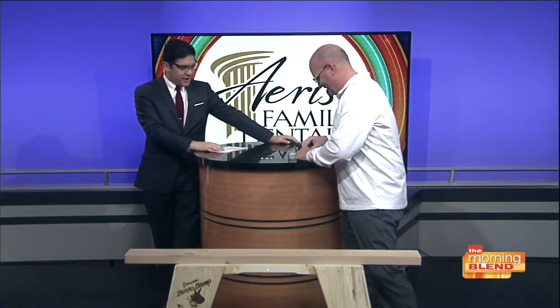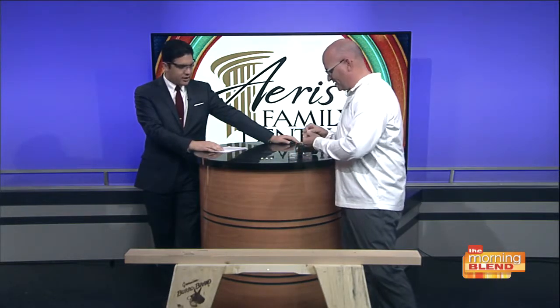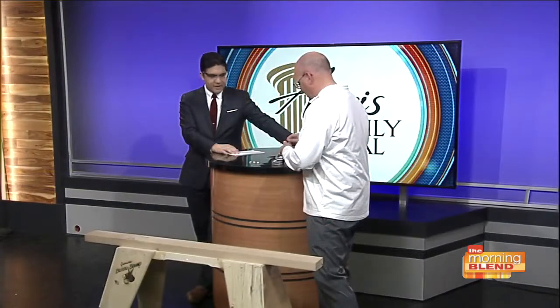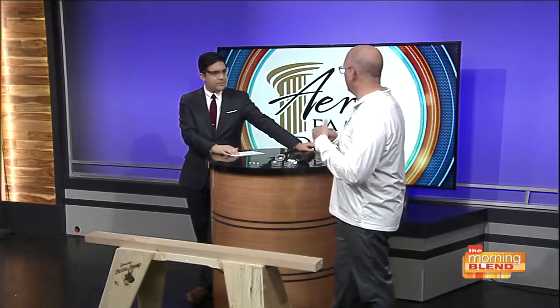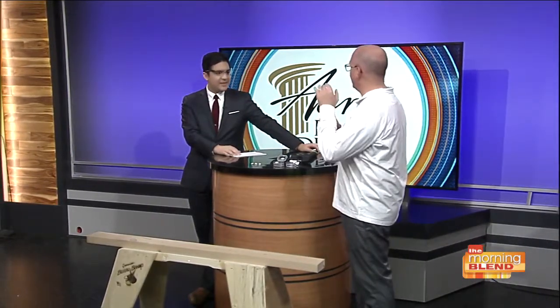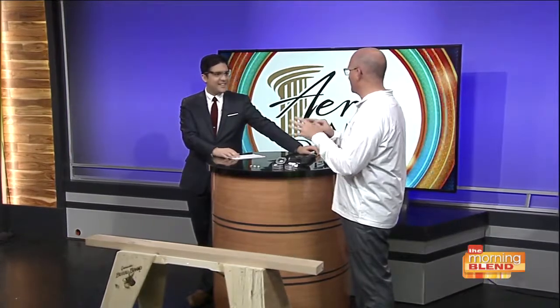All right, let's see what we can do. So show us first what we're going to do here. So we have two identical crowns. I have a couple in this one of the same material. All right. This is the lithium disilicate, which is pretty common in the in-office milled. Okay. But I went one step further. I had my lab mill it with his professional equipment, and I said, you've got to give me the best one possible. Excellent.